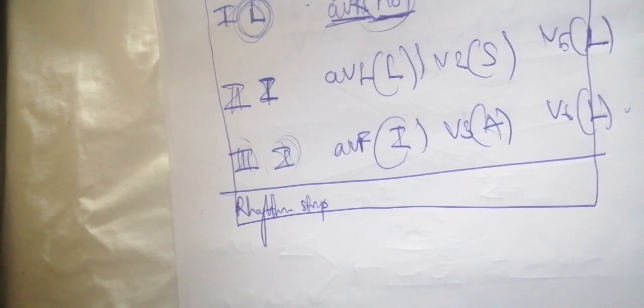So now we are going to move to the next aspect, which is going to be the physiologic interpretation of the ECG.